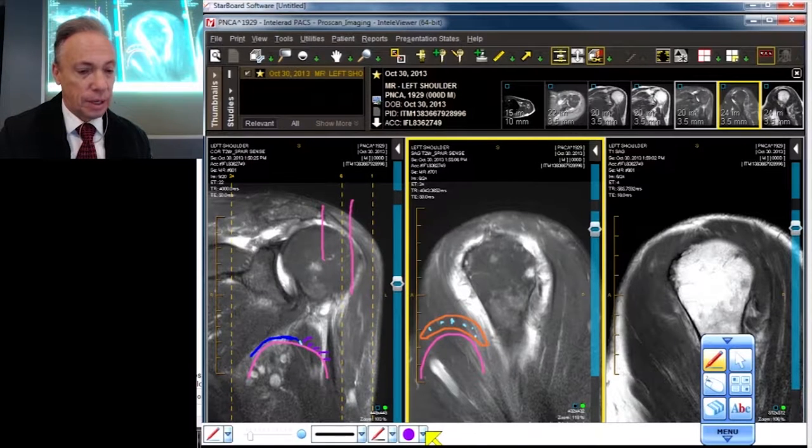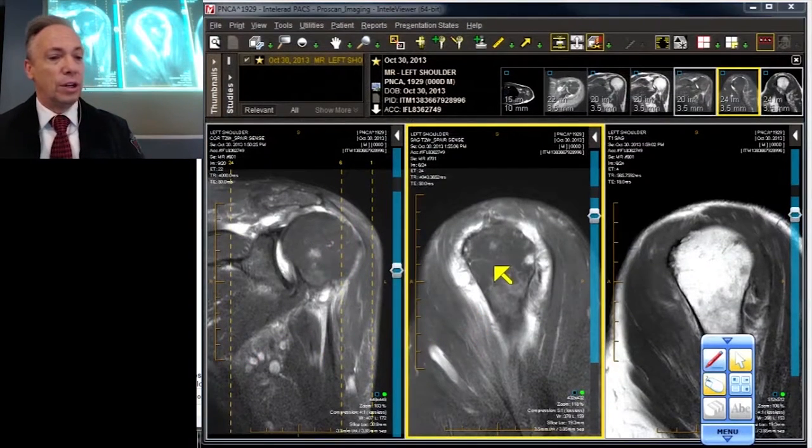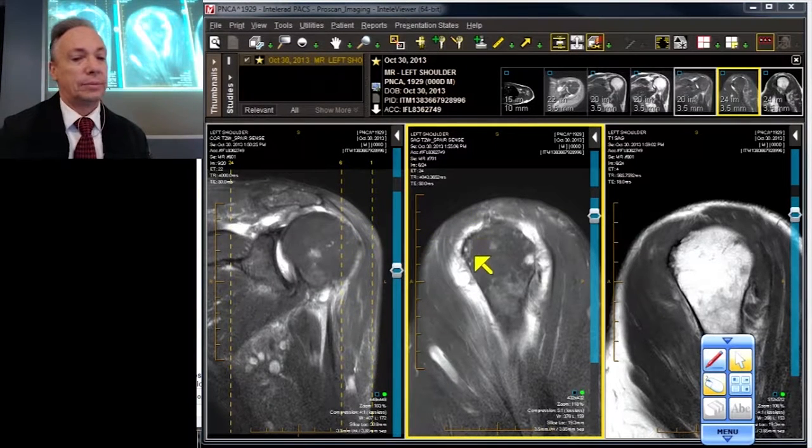Now let's go to our actual sagittal case. You can see from my line that this sagittal slice is out near the periphery or far edge of the humeral head. And to quote a famous author, 'where's the beef?' — there is no beef. There's no supraspinatus, just a ragged fiber remnant lying in a hole.